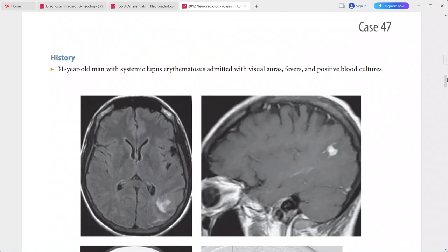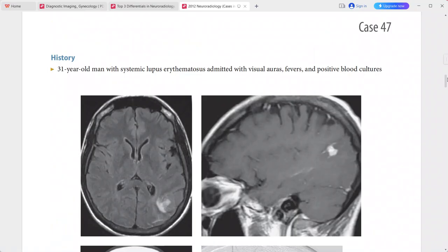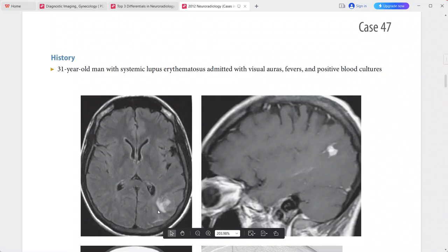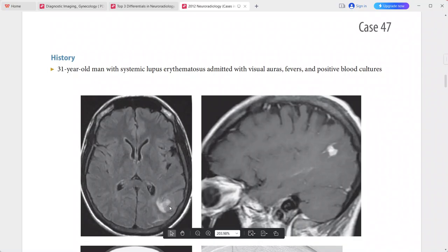Next: a 31-year-old man with SLE, admitted with visual auras, fever, and positive blood culture. MRI FLAIR shows a focal subcortical lesion in the left parietal lobe with heterogeneous hyperintense signal and mild mass effect.